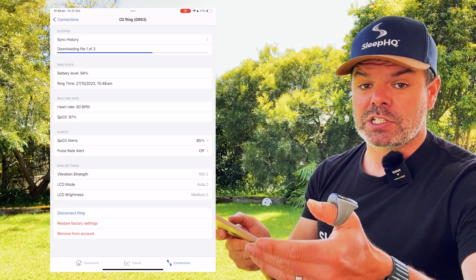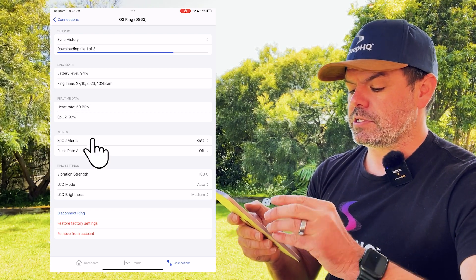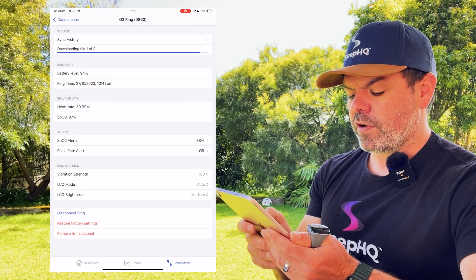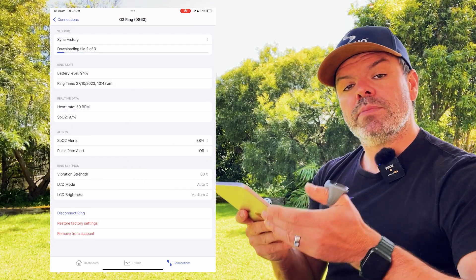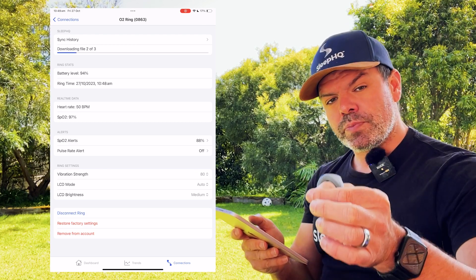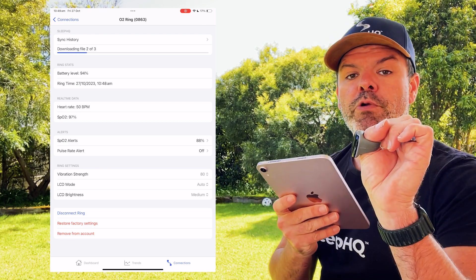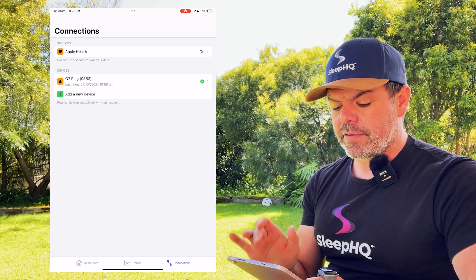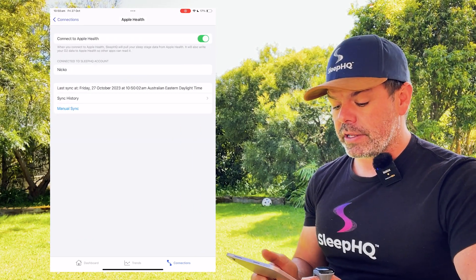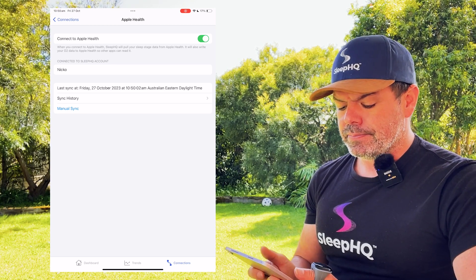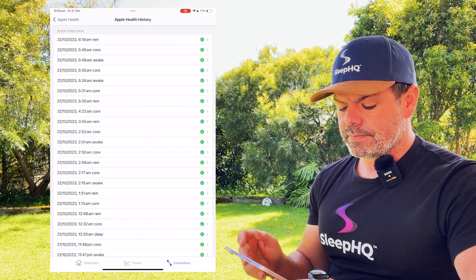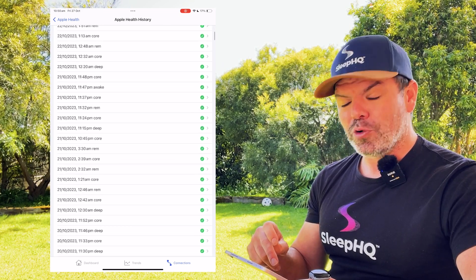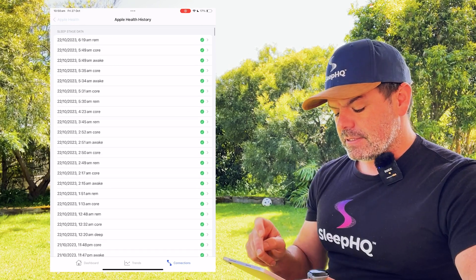And I can set up custom alerts. I'll click SPO2 alerts, choose 88, and put the vibration strength at 80. So if I'm sleeping and my blood oxygen drops below 88%, my ring will vibrate to alert me. And you can see we also have the Apple Health integration — we'll be expanding on this a lot in the near future. I can see the sync history here: all Apple Health data syncing to SleepHQ, all my sleep stage data.